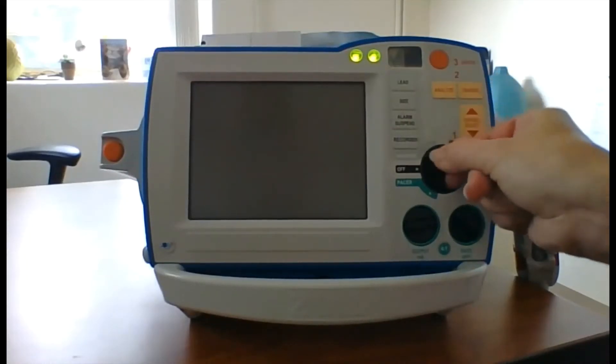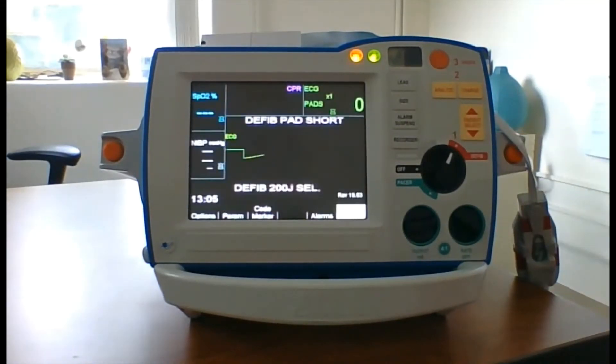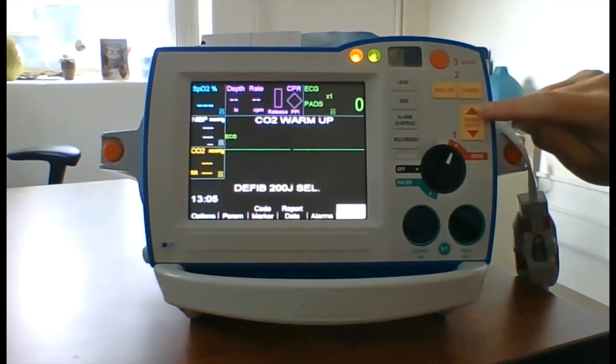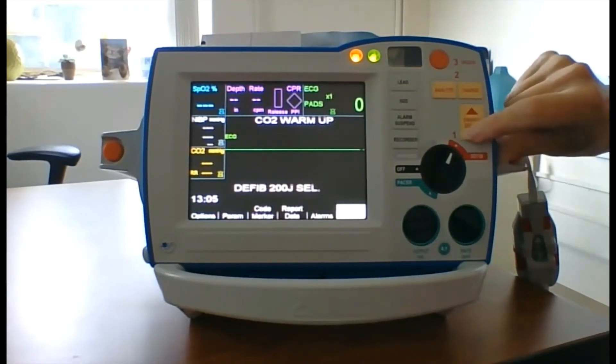To start the defib test, turn the dial to defib. We are first going to perform the 30-20-30 test. Using the Energy Select button, scroll down until the screen reads 30 joules.